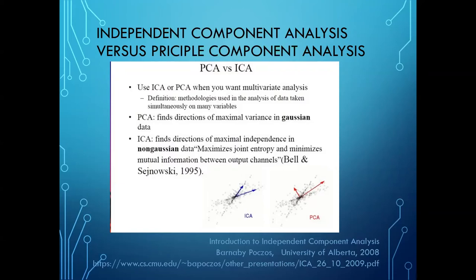Now, there's even a better one, but it's not part of the WinEEG at this point, and that's called Amica. It's an advanced mixture of ICA techniques. It's actually multiple ICA techniques all kind of packaged together. And it's been shown to be very superior in the extraction of muscle. If you're looking for eye movement extraction, they're all pretty close to the same. If you've got somebody with very well-controlled eye movements and the eye movements are down the list of components in the fast ICA, it may not be quite as accurate as either of the other two approaches.